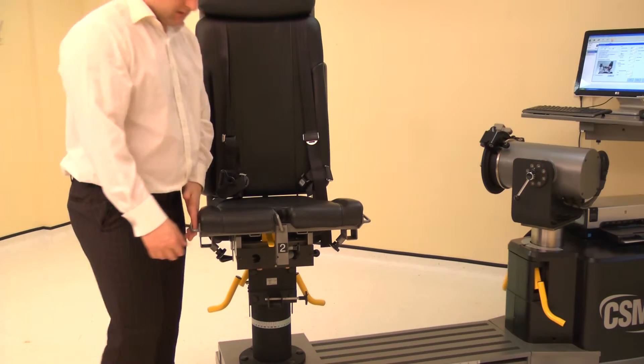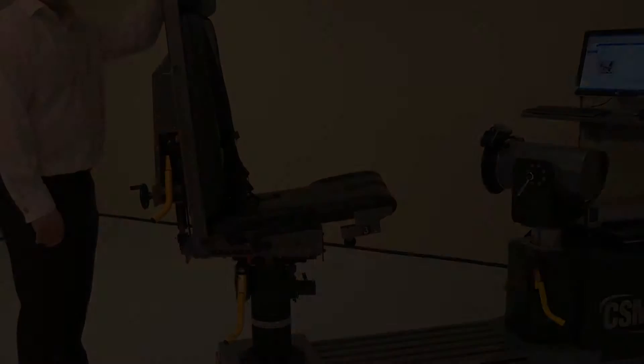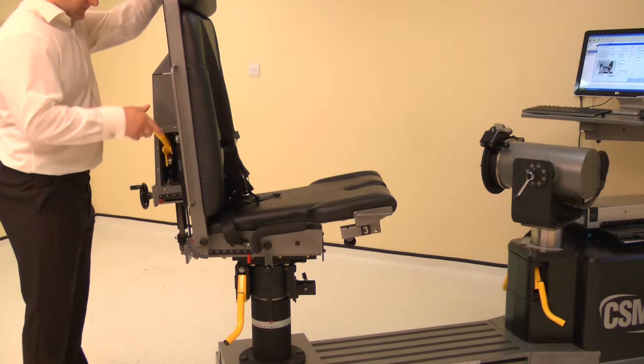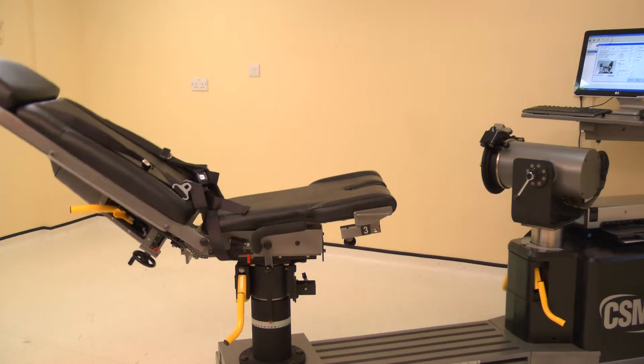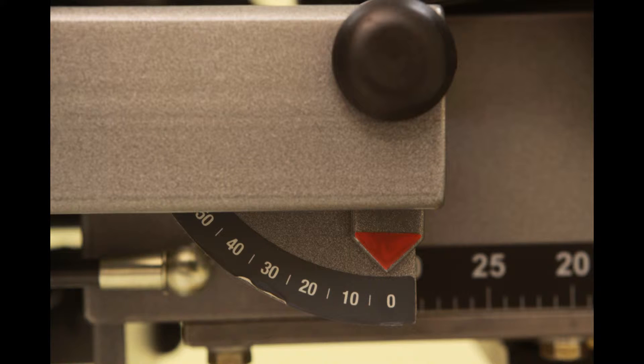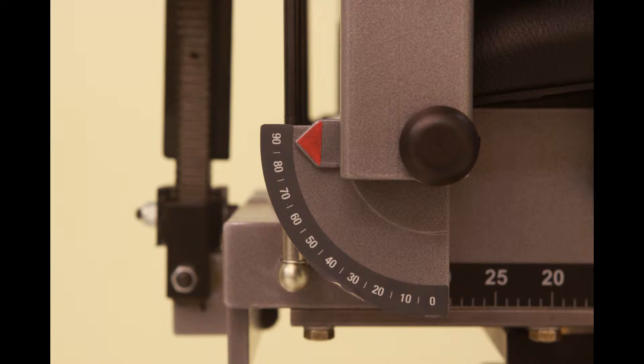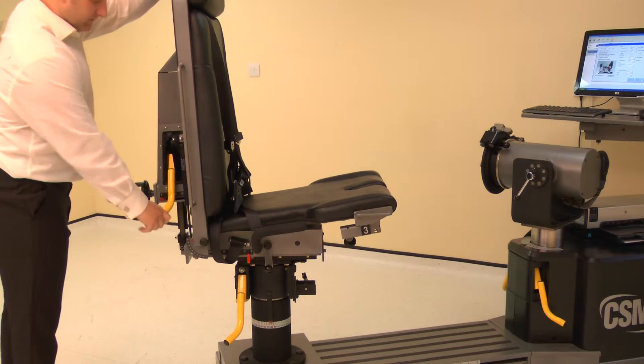Set the seat to the down position by lifting the seat and releasing the lock. To set the chair back angle, lift a locking handle and adjust the chair back angle to 0 degrees. If using the chair for stabilization, set the foreaft position to 90 degrees. Ensure both locking handles are pushed down to secure.